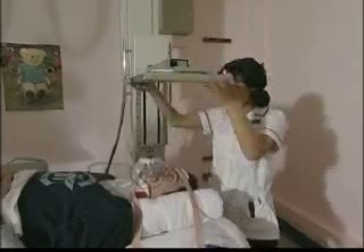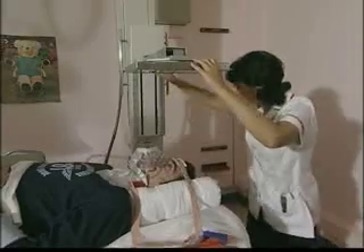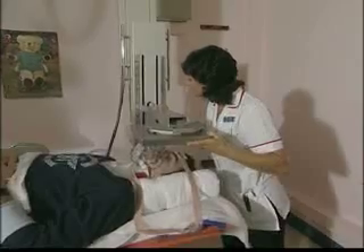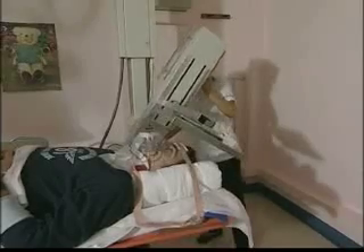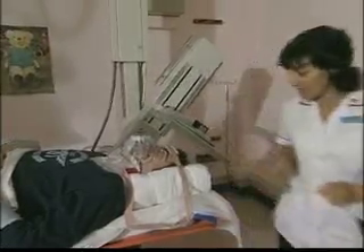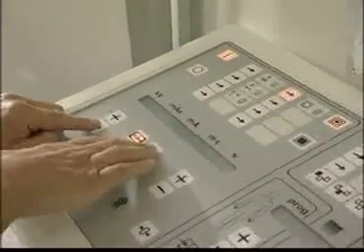This will come down in front of your face but it's not going to hurt you. You hold very, very steady there for me. That's our first picture ready to take. Having checked the alignment, the radiographer withdraws behind a lead glass screen, selects the exposure — OK Alan, nice and steady for me please — and proceeds with the X-ray.